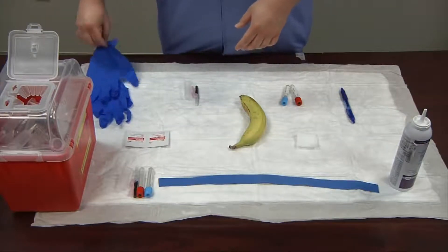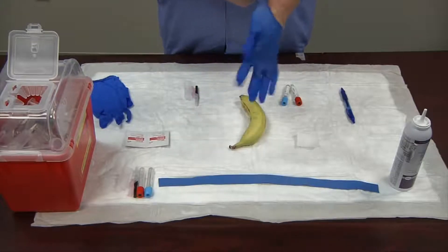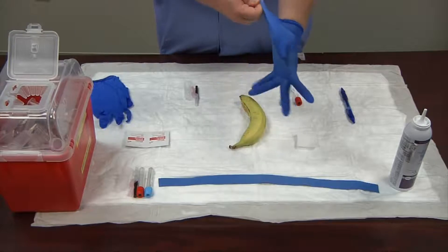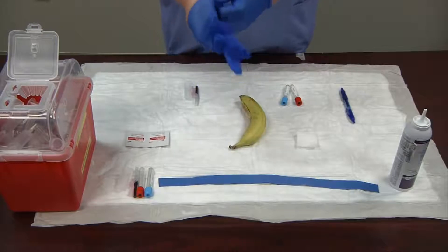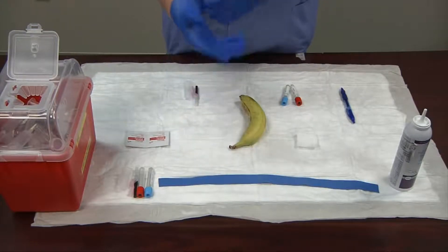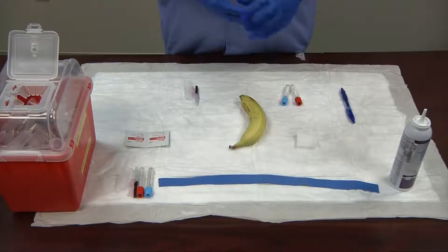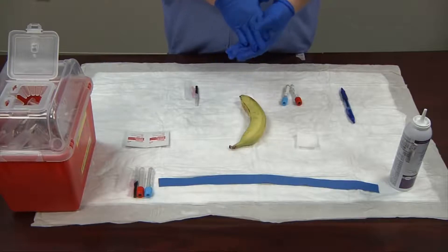Now I'm going to don my gloves. Make sure that you have a good, tight, snug fit. Your fingers should be good and snug in the gloves — you don't want too much excess on the fingertips. In phlebotomy, you need a good tight feel against your fingers so you can palpate the vein easily.